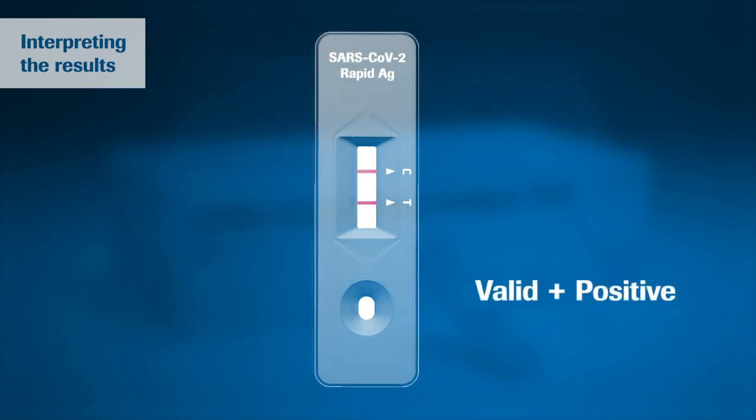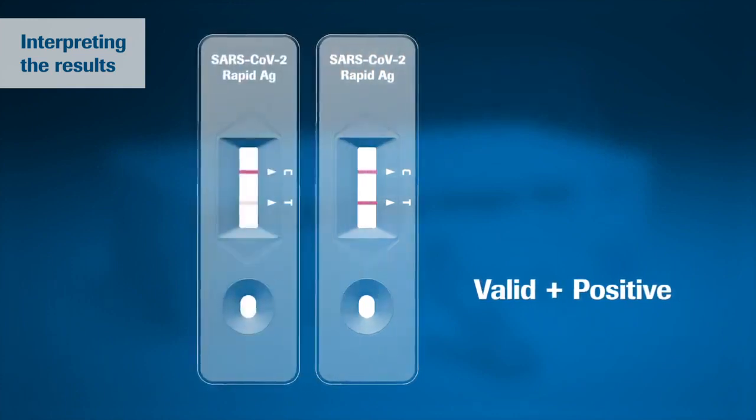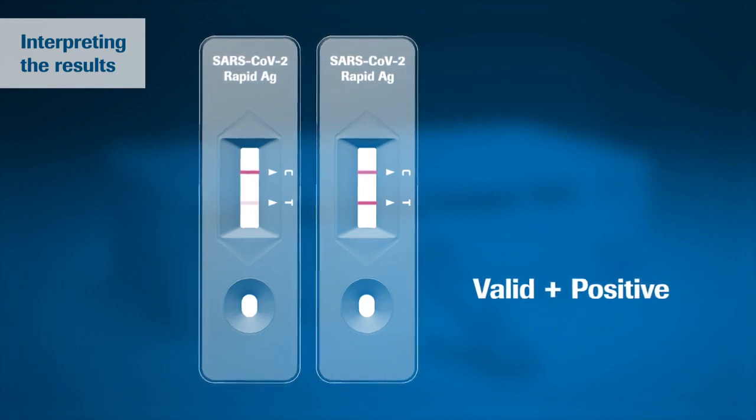In case of a positive result, a colored line appears in the lower section of the result window. This is the test line T. Even if the test line is very faint or not uniform, the test result should be interpreted as a positive result.